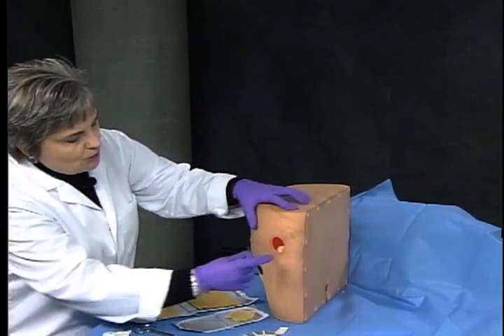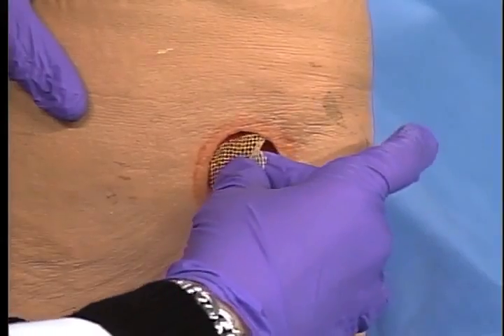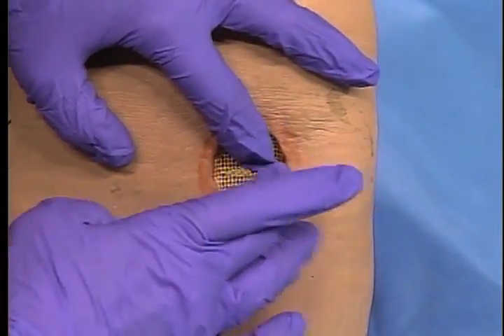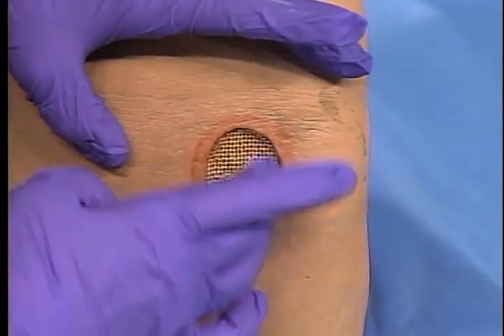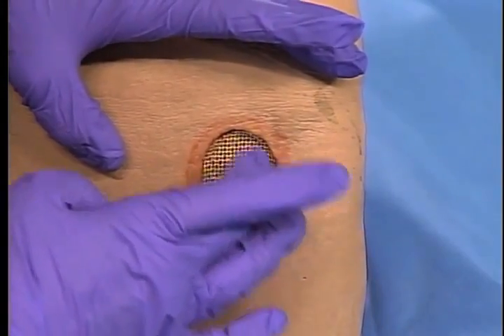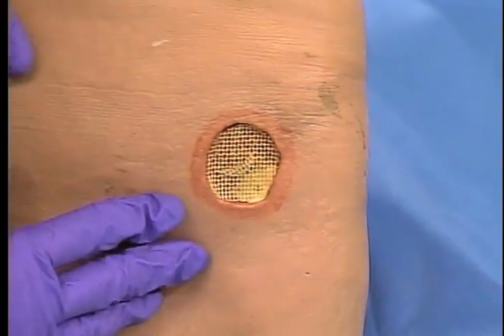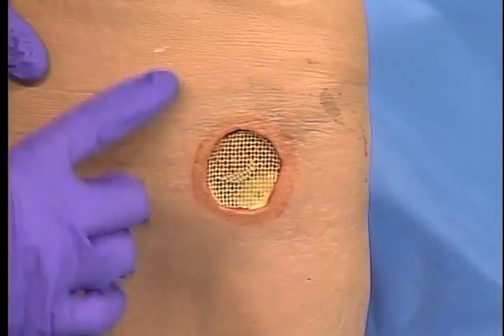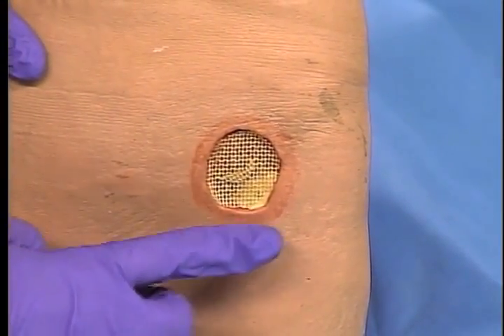And we're going to talk a little bit more about the fluids you use to moisten the dressing in just a moment. So I'm going to take my dressing, and in this particular wound I've got enough drainage, so I'm just putting the product in dry. And you can see how I've just laid it inside the wound bed, just gently tucked it in with my gloved finger, and I've made sure that the size is appropriate so there's no overlap on the surrounding skin.